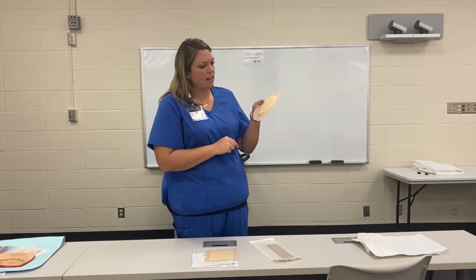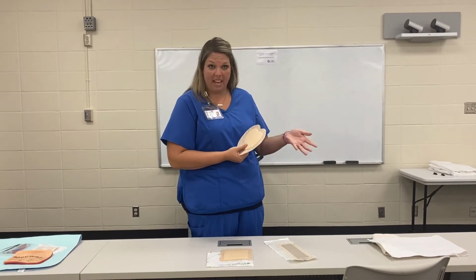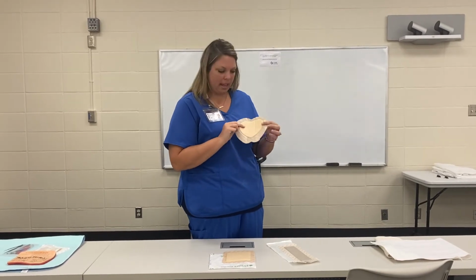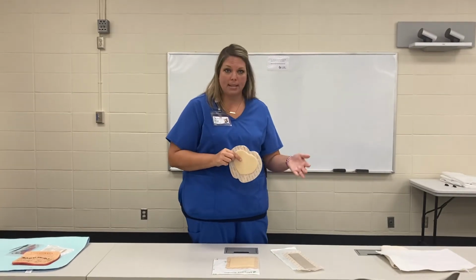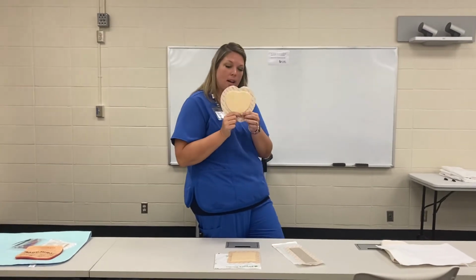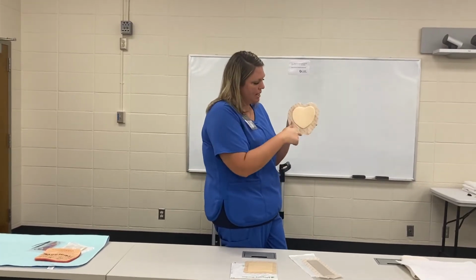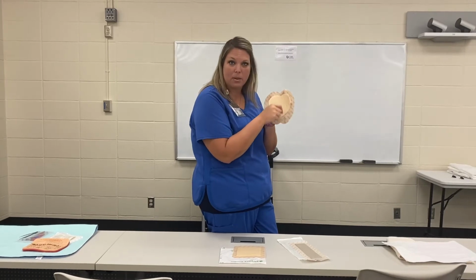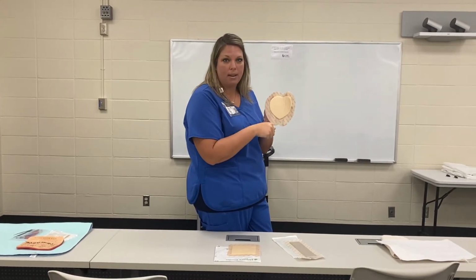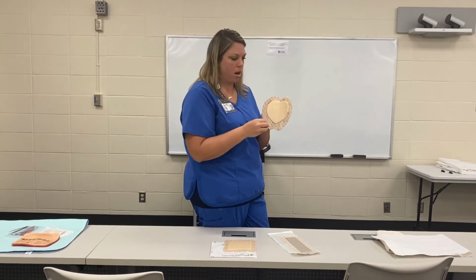So if you have a patient that's high risk, or they even have a little bit of area that won't blanch, we can get a Mepilex dressing and place it over it. If I have an elderly client, like we talked about Mr. Johns in the case study today, and he had an issue on his coccyx, I would take this dressing and apply it to his sacrum. You see the shape of it. These dressings are good for 7 days. When you're assessing your patient, they'll be timed and dated with the nurse's initials of when it was applied. Now, the key to these dressings, you must remember to assess under them.